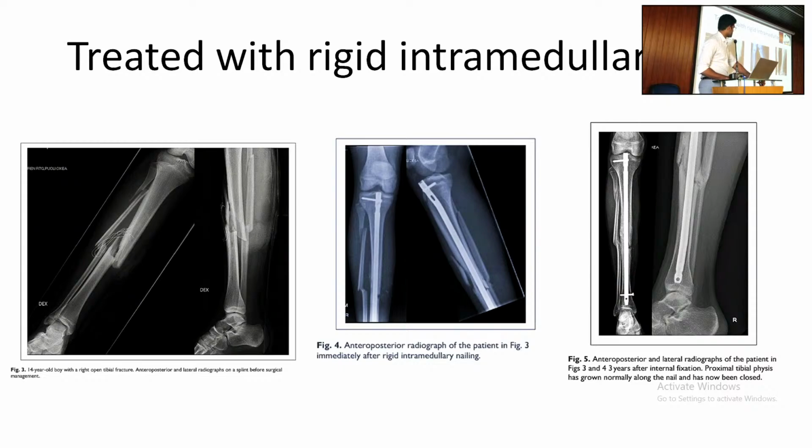So what type of nail is this that they have used, that we don't have? Is it a solid nail or a hollow nail? It looks like a hollow nail with thick holes here. It's not a solid nail. Is there any name mentioned for the nail? I don't know, sir. They didn't mention it. Can we use a V nail here? It functions the same way. You know what a V nail is? Yes, sir. But there are no holes for interlocking. Interlocking can be done.